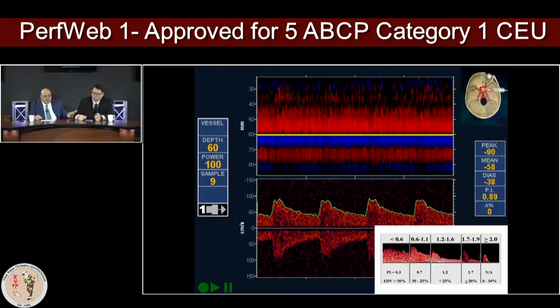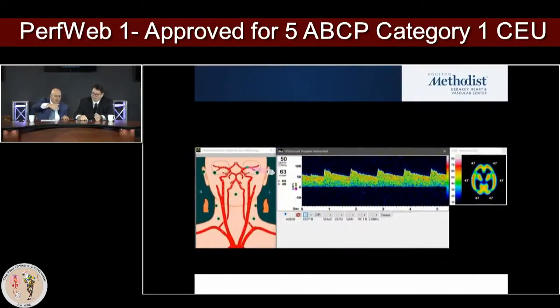Mm-hmm. So can I just throw this out? So when they pick the heart up and they restrict the drainage from the superior vena cava, when they're really torquing it over to get to an OM graft or something like that, and our flow goes down, we're struggling for volume, and we're assuming, of course, I think reasonably, that the head is getting congested.